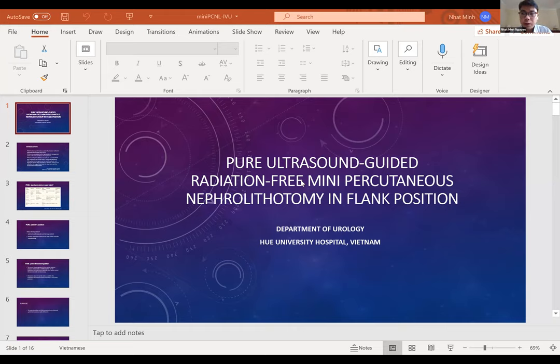I would like to introduce the mini PCNL in our department. We started doing it about 3 years ago. We try to do it with ultrasound without the C-arm, but sometimes in a difficult case, we can combine the ultrasound and C-arm.